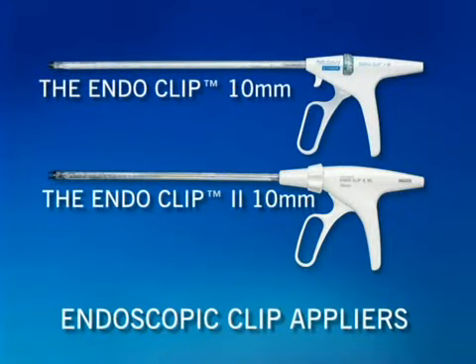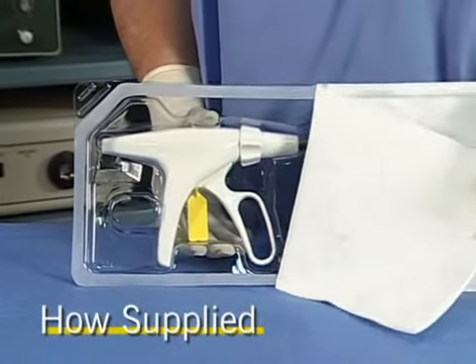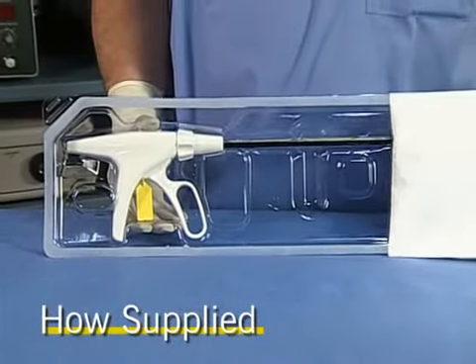This in-service video will provide basic instructions on using the 10mm EndoClip and EndoClip 2 clip appliers from Autosuture. Please refer to the instructions for use packaged with the product for more information.